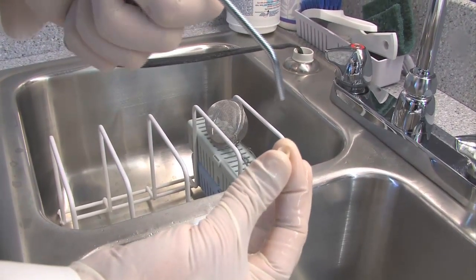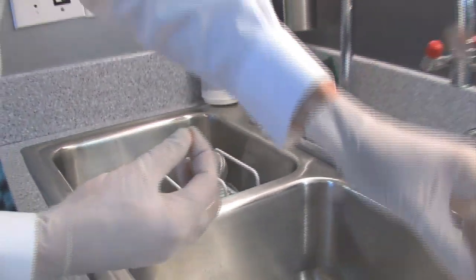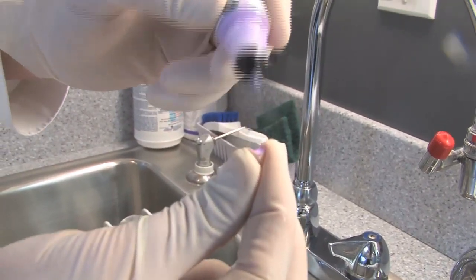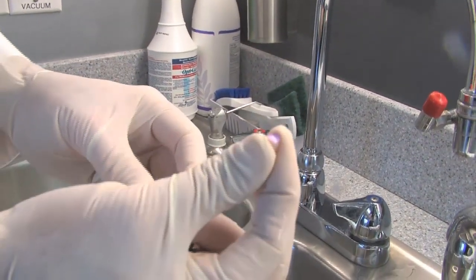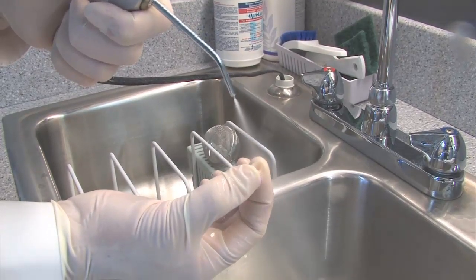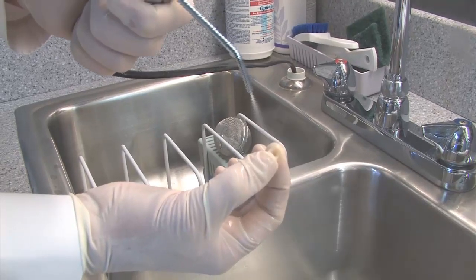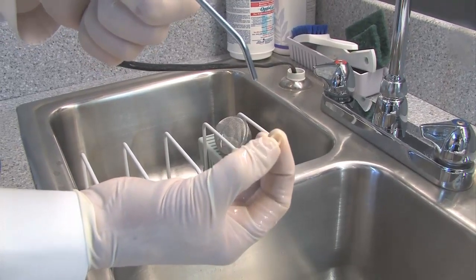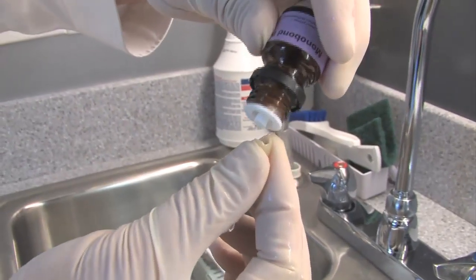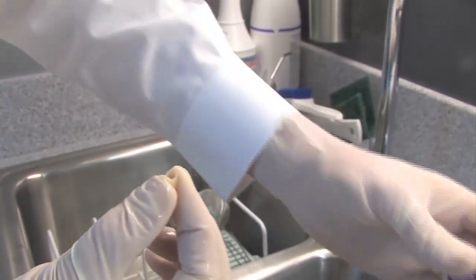After we take the crown and try it in and the patient looks at it and gets their approval — this happens to be a solid zirconia crown — because of the possibility of contamination from the phosphate groups in the saliva, we're going to use a zirconia oxide solution and put that on the inside of this crown for 20 seconds, and then rinse that out. Because it's a liquid zirconia oxide, any of the phosphate groups from the saliva that were bound to the zirconia crown are now going to be bound to the purple liquid, and we rinse it right out.